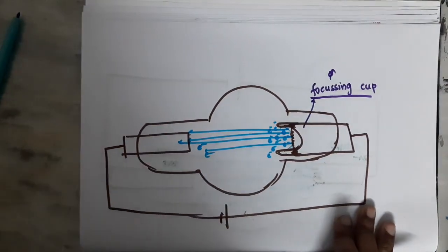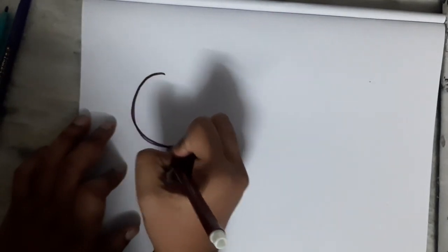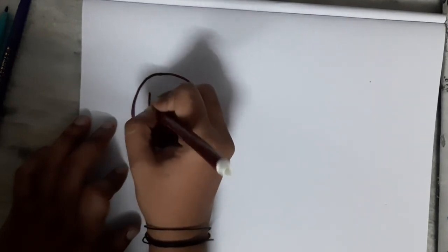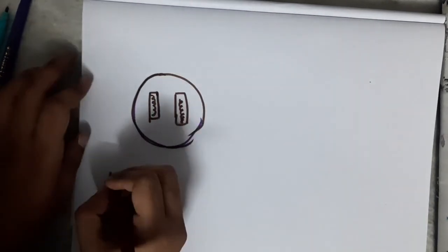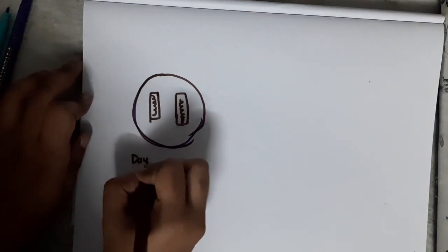Nowadays we have started using more types of X-ray tubes. One such modification in the cathode is the usage of double filament. So if this is the focusing cup, the same thing I'm drawing here. This is the focusing cup I'm drawing in this color, and we have two filaments. One is the large size filament, the other is the small size filament. So this is called a double filament.